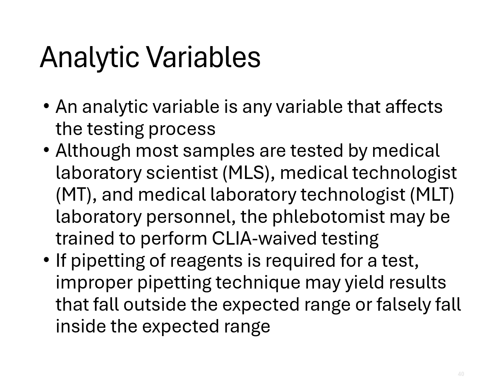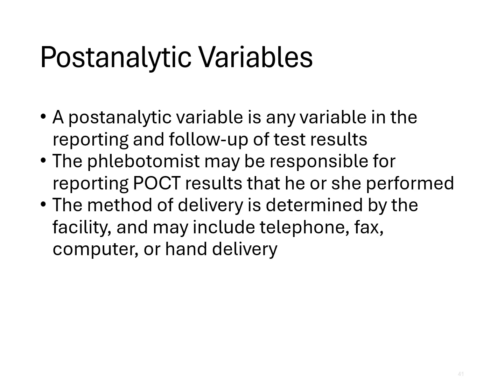Analytic variables. So an analytic variable is any variable that can affect the testing process. Although most samples are tested by your medical laboratory scientists, MLSs or MLTs, they are going to usually be the ones that are training the phlebotomist in these CLIA waived tests. So if pipetting of reagents is required for a test, improper pipetting technique may yield results that fall outside the expected range or falsely fall inside the expected range.